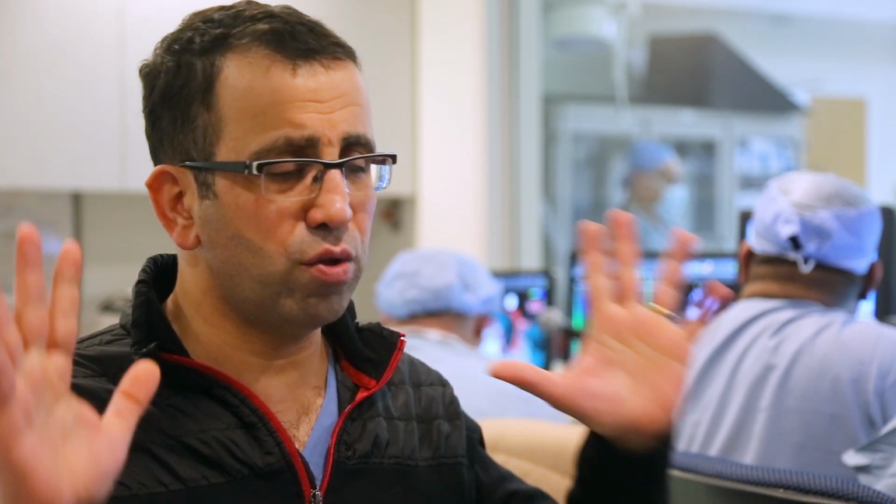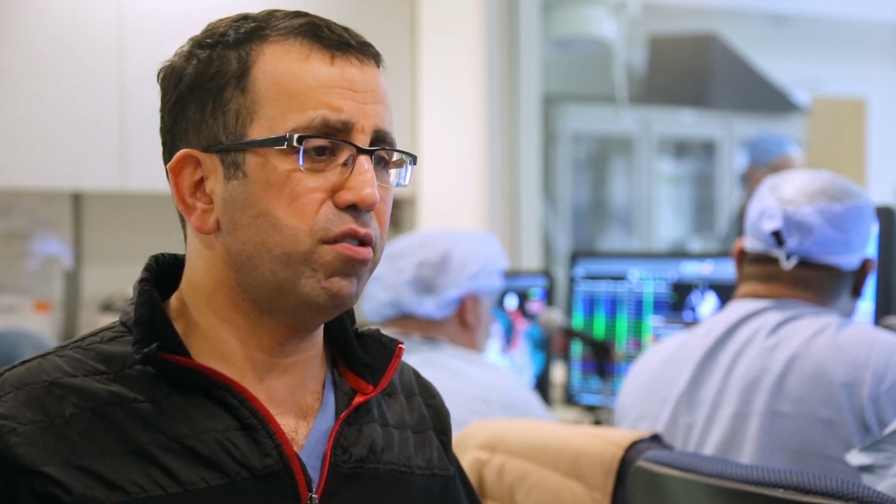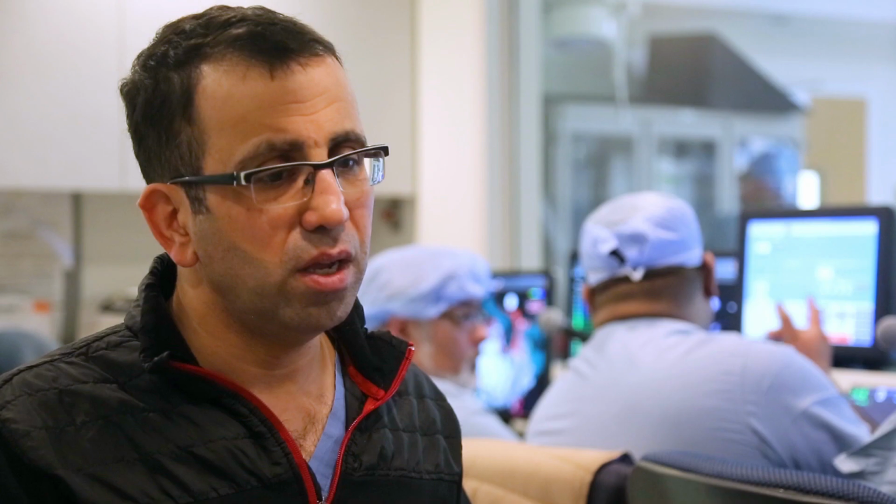Or you're going to use this approach, which is more physiologic, if you will, that you know that the veins are isolated and you're specifically looking to find areas that are responsible for initiating atrial fibrillation. We find this approach to be more specific.